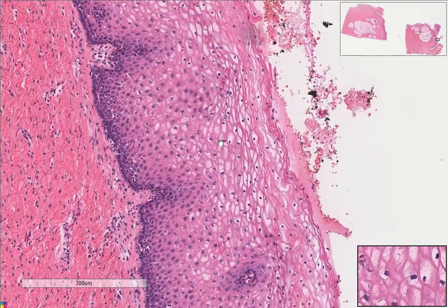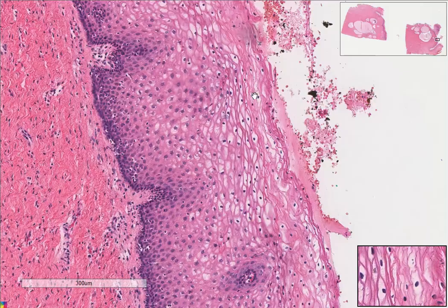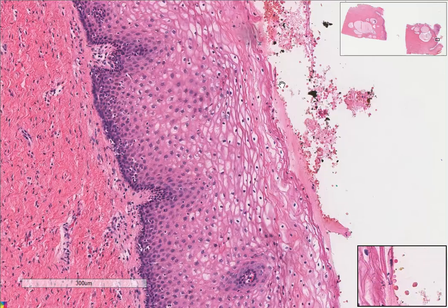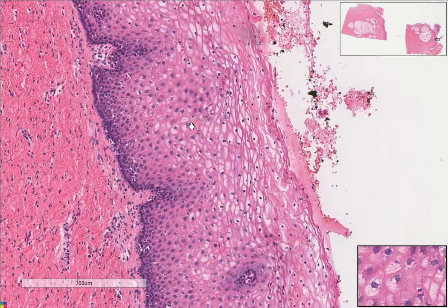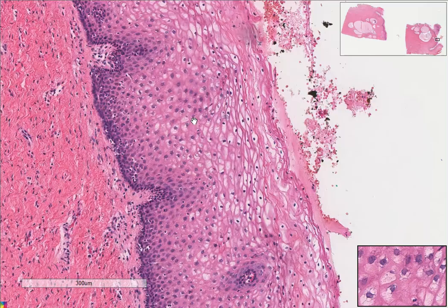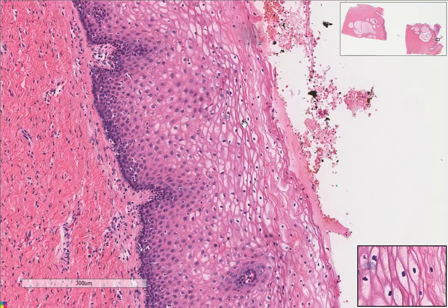So when we say there's a carcinoma in situ, you see this normal progression in the epithelial cells, the normal maturation, is distorted. So there's what we call CIN 1, 2, and 3, or low grade squamous intraepithelial lesion to a high grade squamous intraepithelial lesion.